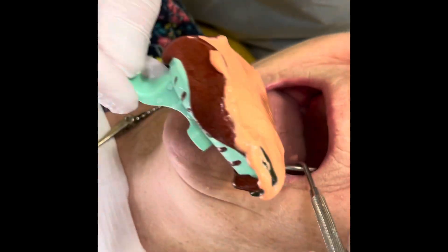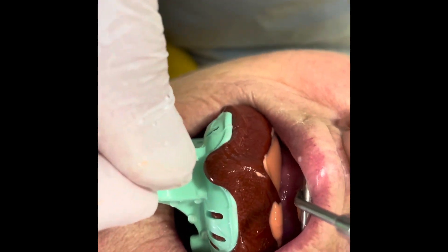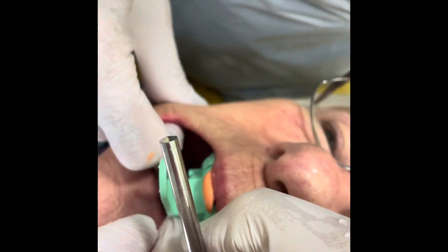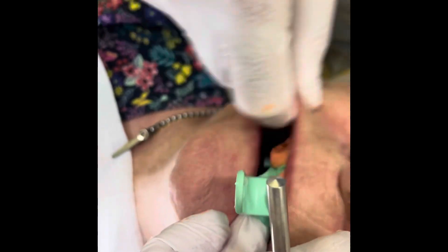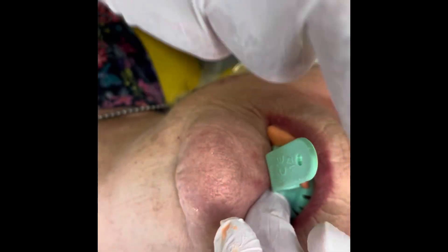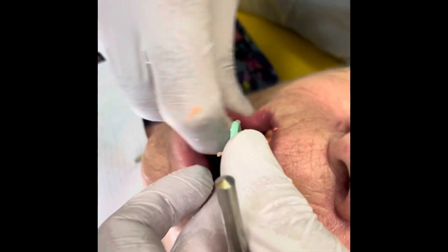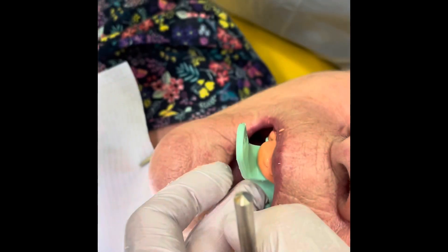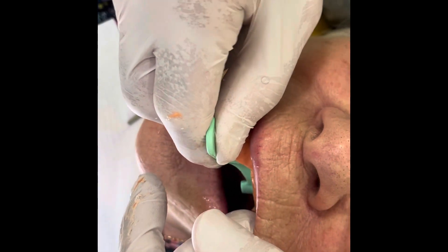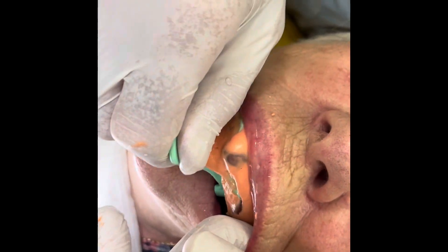Now the upper. The critical thing with the upper: get the back in first, right against the back of the palate, so the excess comes forward. Watch it go over the ridge — you're pushing at the back, then you pull the front up. Close your mouth a bit, relax your face. Border moulding — you're pulling the excess round towards you, then squeeze between the nose and the top lip. This is where you have to keep pressure on the tray all the time. Move your chin left or right, and then it's set. When it's set, gently pull it out — pull the cheek out of the way to break the seal. Don't pull the front down; it digs against the ridge. Just follow the path of insertion and pull it out.